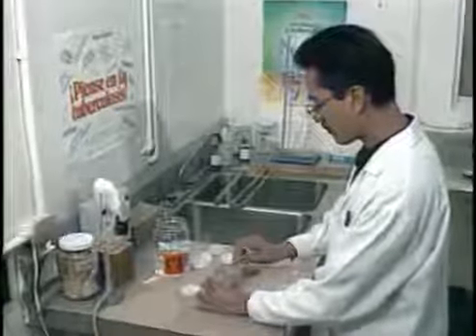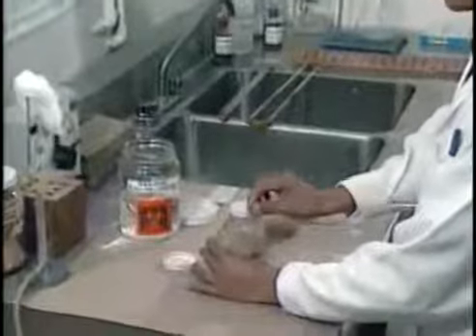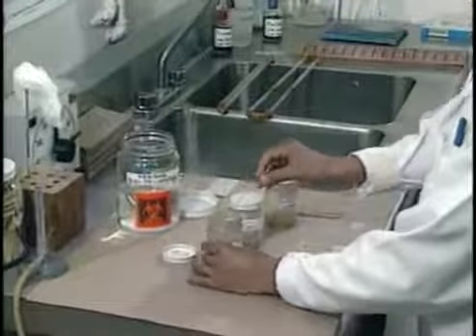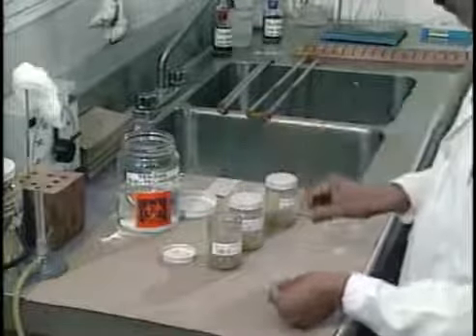Using either a wooden applicator stick or a loop, pick out portions of sputum for examination. Solid caseous particles often produce the highest number of bacilli. Using a continuous rotation, cover an oval area approximately 2 centimeters in length on the slide. Put only one smear on each slide.